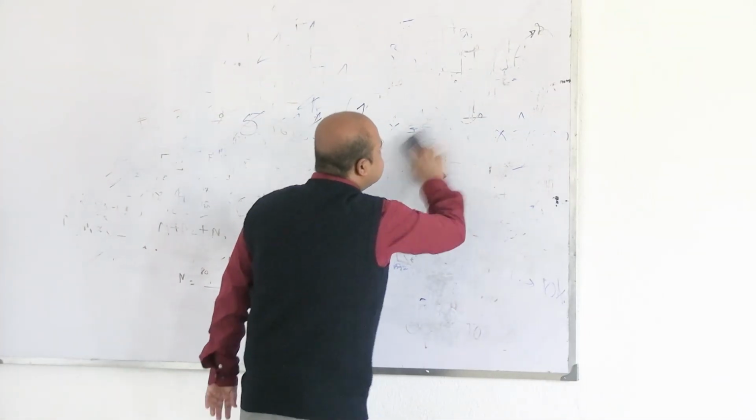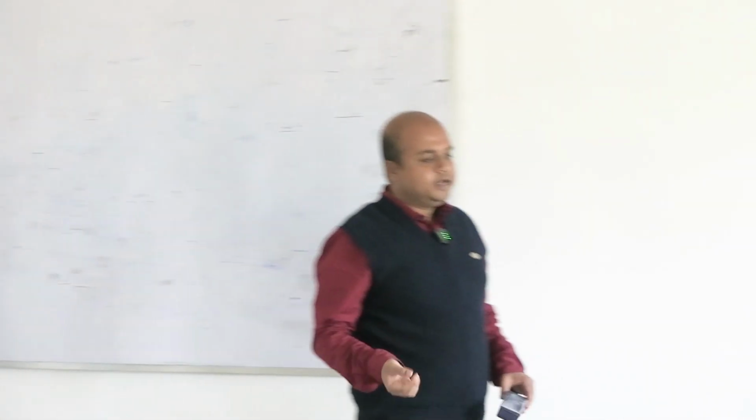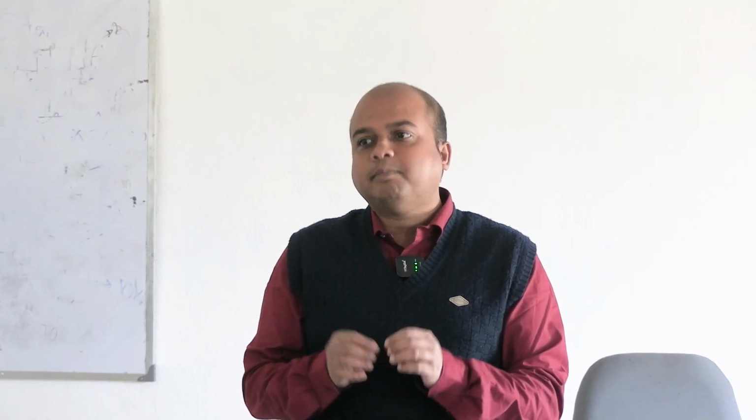So a better way to write is this one. Like I have told you in bleeding time, if you say it's 3 minutes, okay, I have not got the 6th spot or I have not got the 7th spot, so it is 30 into 7, it's okay. But it's better to say that I have got the 6th spot but not got the 7th spot. So 30 into 6 is 180, 30 into 7 is 210. The result is somewhere between 180 seconds and 210 seconds, or 3 minutes and 3 minutes 30 seconds. That should be a better answer.